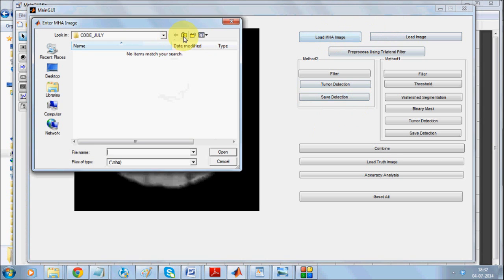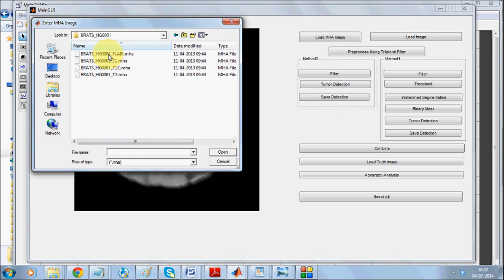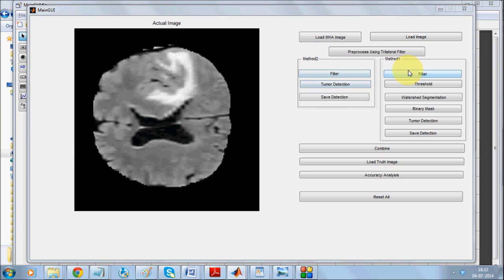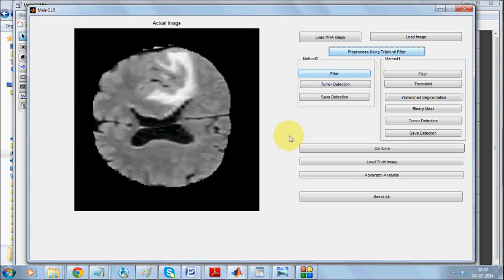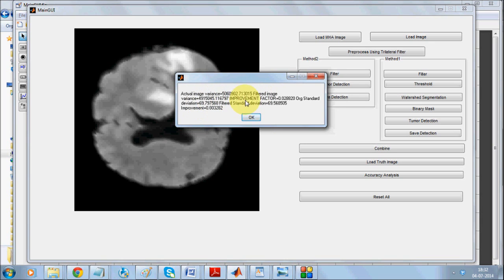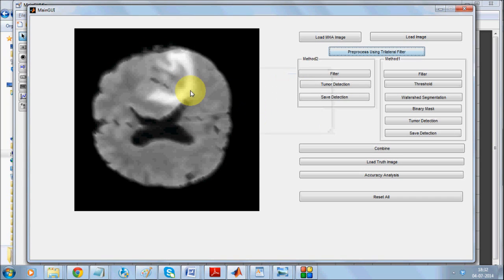Now we are going to once more load the same image, which is image number one. As trilateral filter is common to both techniques I'll be applying it. As you can see, after the filter is applied it presents statistics: what is the variance of the original image and the current image, what is the improvement, and the standard deviation. The modified image should have less standard deviation.